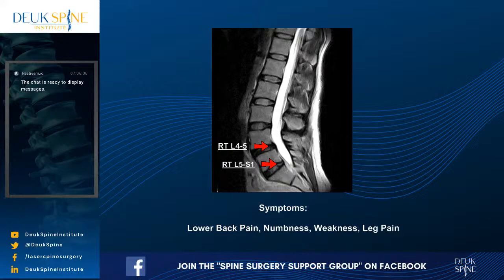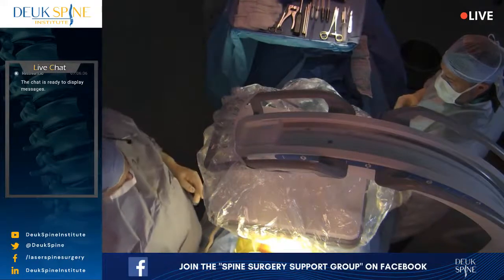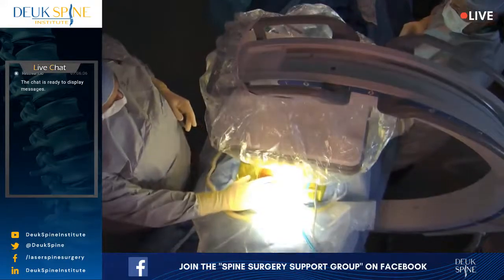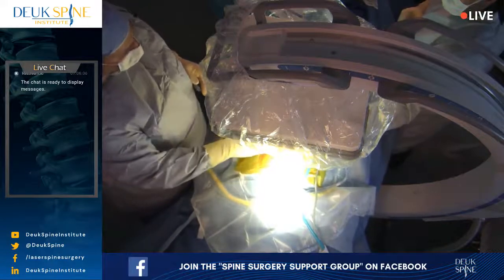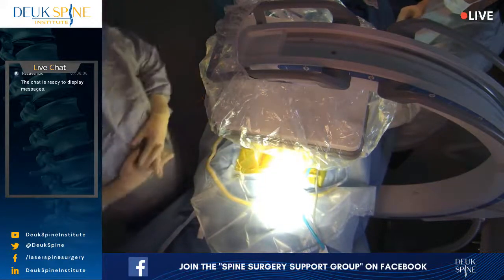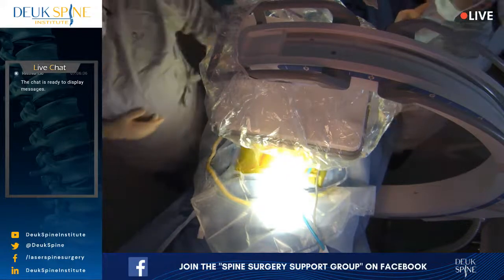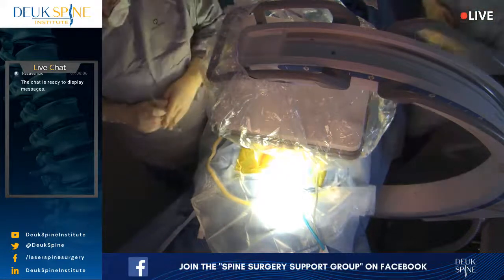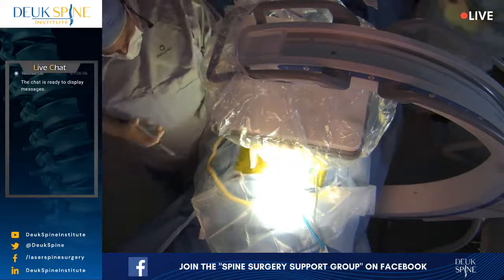I'm going to talk to her right now and let her know I'm here. It's Dr. Deukmedjian. We're going to get started, okay? All right, now her family is watching, and she wanted me to do a big shout out to them. And they're watching through Facebook. She okay? We ready to get started? I think so. She might be a little sleepy. Blood pressure looks good. I like my systolic pressure around 100 to 110 max. Dr. Deuk here, we're gonna get started.